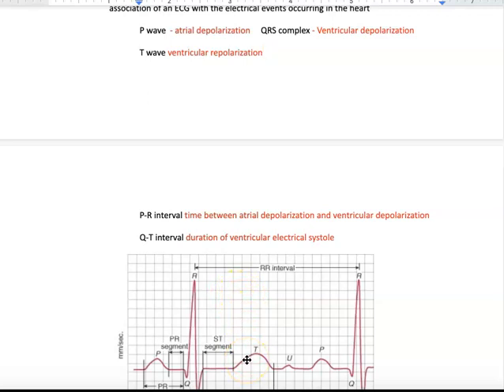So what is missing that should be happening? And it is happening, you just don't see it. And that is atrial repolarization. That is buried in this QRS complex. So it's very small, but it is buried there. So when the atrium are depolarizing, okay, they depolarize, they repolarize, while the ventricles are depolarizing. Okay? And then here, because the ventricles are so big, it's not buried under anything, you can see the ventricular repolarization. Okay? You can see the ventricular repolarization.